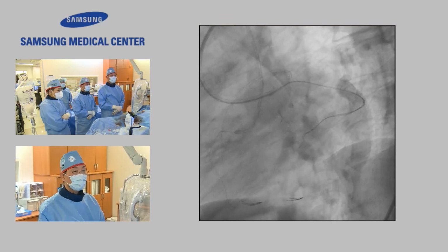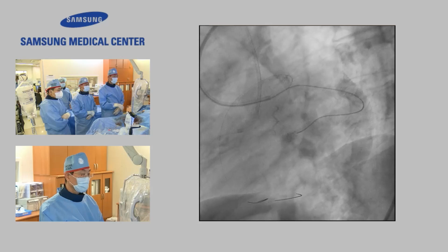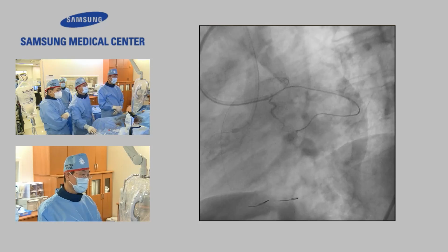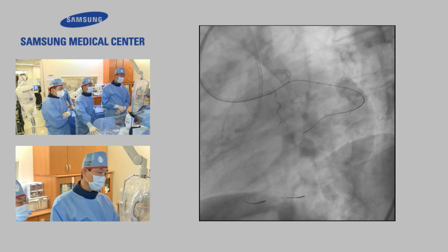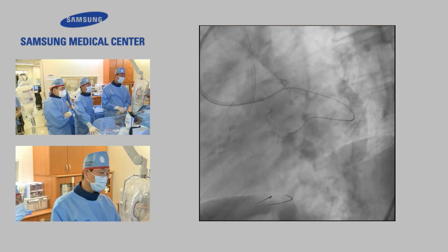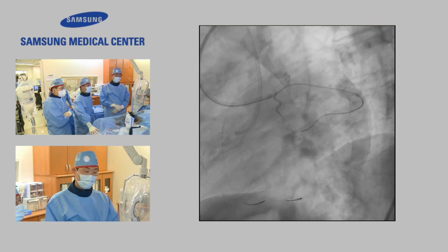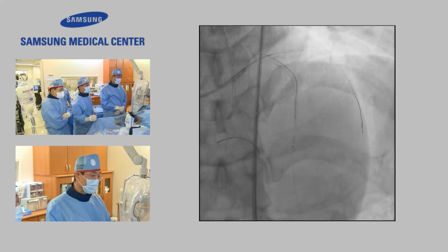I can show you the ostium by the IVUS, but we are now considering the retrograde approach at this time. So I'm afraid of cardiac tamponade. At this point, we can perforate the collateral here. It will end up with cardiac tamponade. Anyway, we tried. Next.